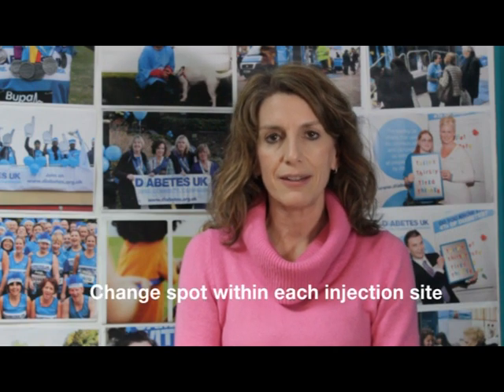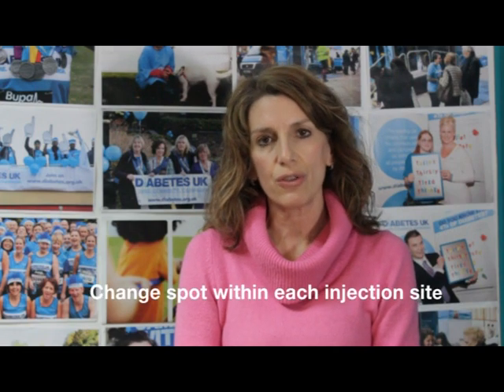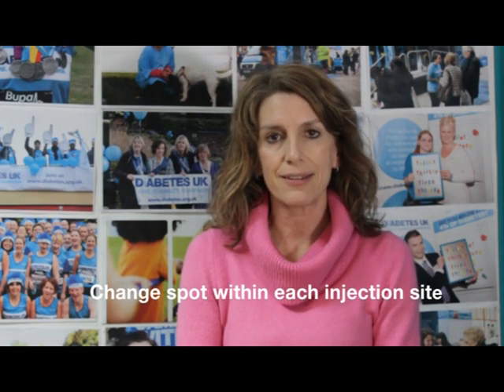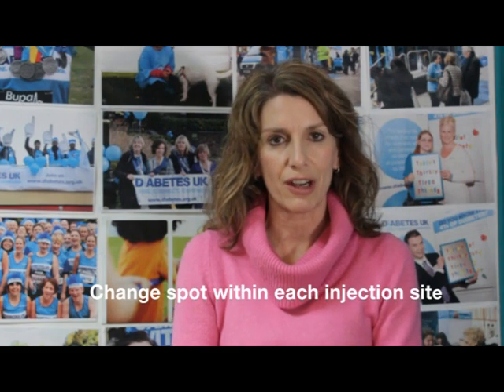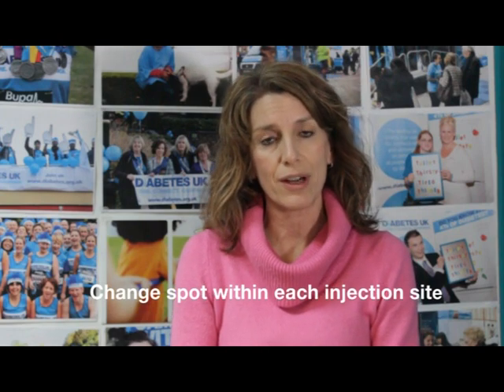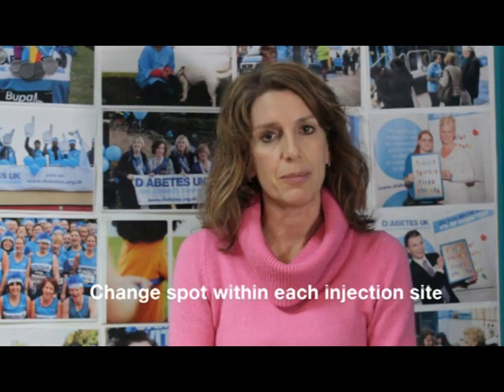Also, as well as rotating the site you inject, you should also change the spot within each site. If you rotate the sites and spots of your injection, you'll help avoid lumps forming and any that have already formed will gradually disappear.